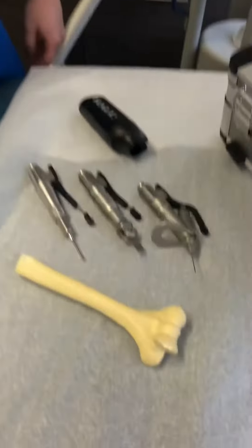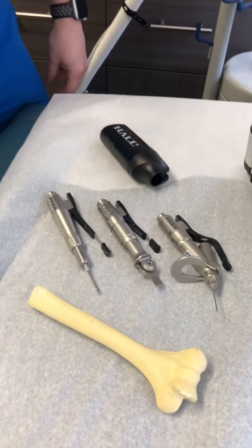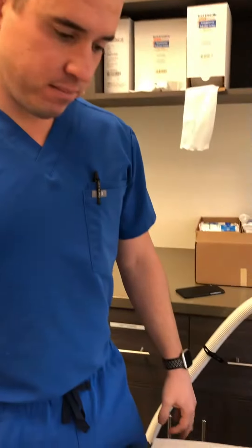Hey everybody, today I have David from ConMed. Hey David, how are you? He's a seasoned company representative. He's here to show me some new technology — new drilling and burring technology. As some people want to know, we love our tools in orthopedics. We absolutely love them, because they're actually essential for what we do.